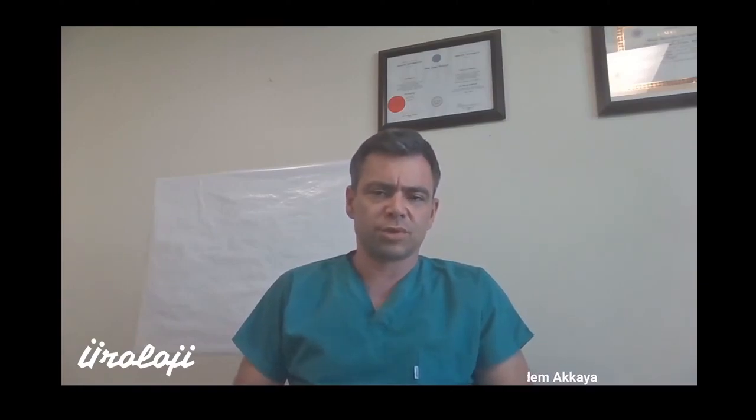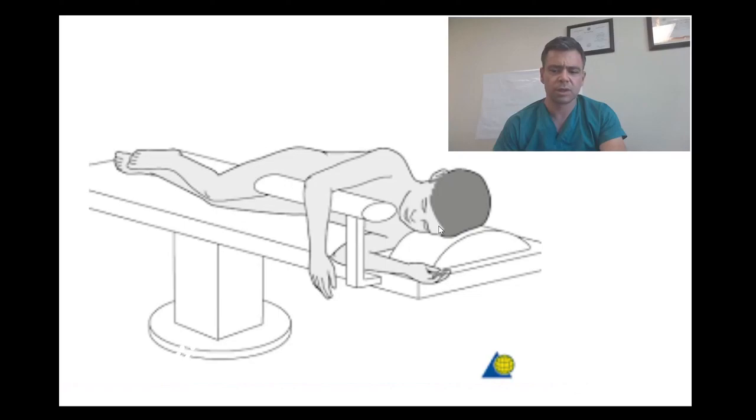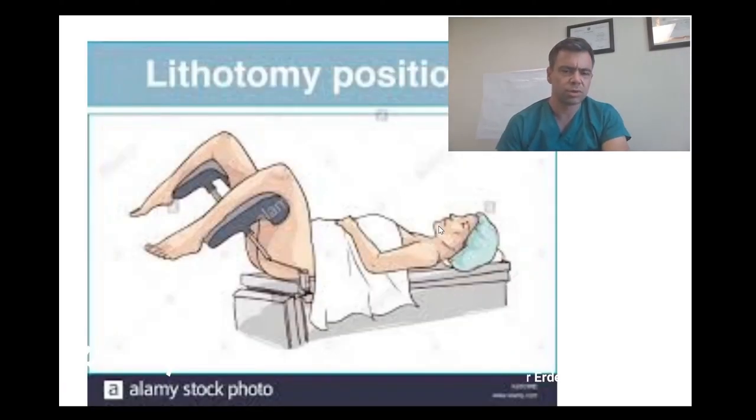In prostate biopsy, in urology, we do it by entering from the anus with an ultrasound probe, observing the prostate, and taking samples from certain quadrants of the prostate. To briefly describe the position, the prostate biopsy is done, as you can see on the screen, in the side position or in the woman's birth position, which we call the lithotomy position.